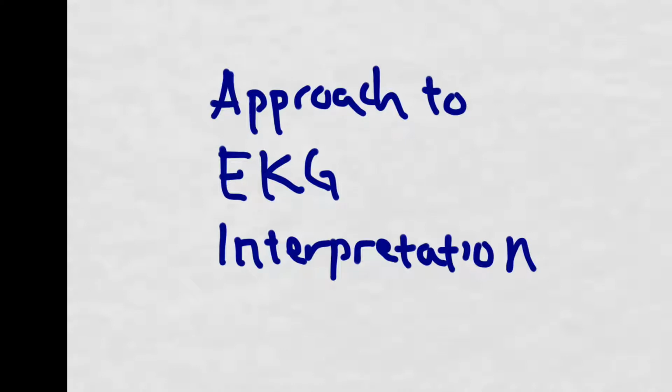Instead of honing in on a lot of the nitty-gritty, what you really want to focus on is the bigger picture. And that's what we'll talk about today, an alternative approach to EKG interpretation that actually allows you to look at the bigger picture. The big picture being, why did I order this EKG? What am I specifically looking for? And with that answer, what am I going to do with the information? How am I going to intervene on this patient? What are the things I cannot miss? So let's get started.